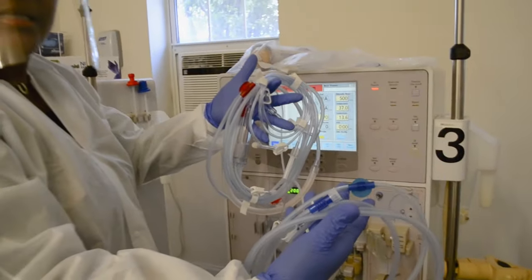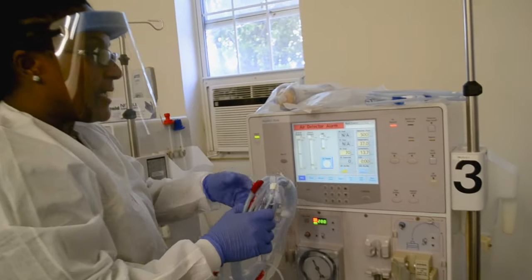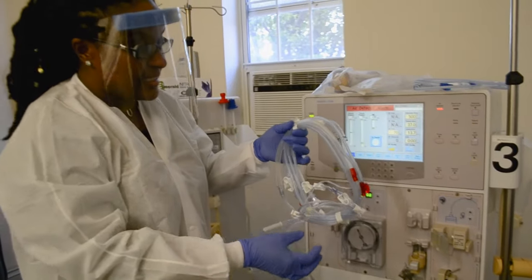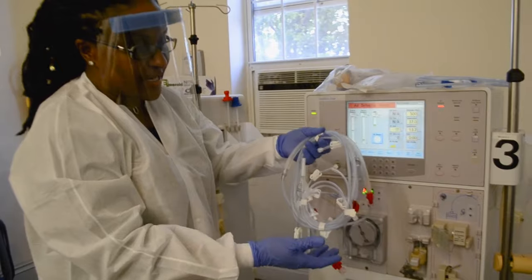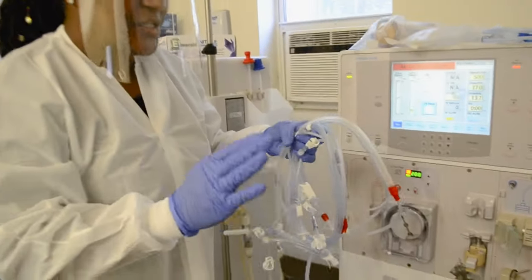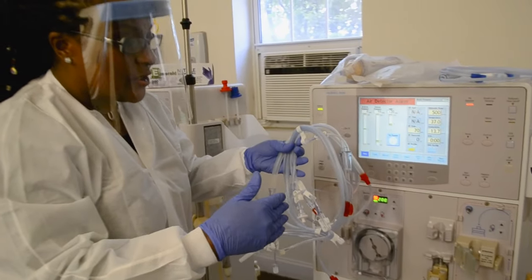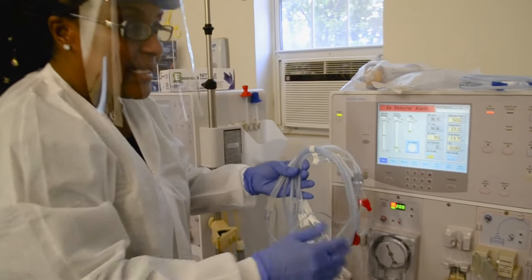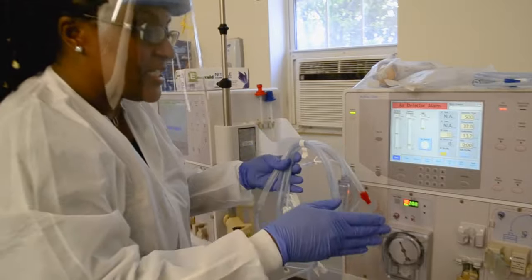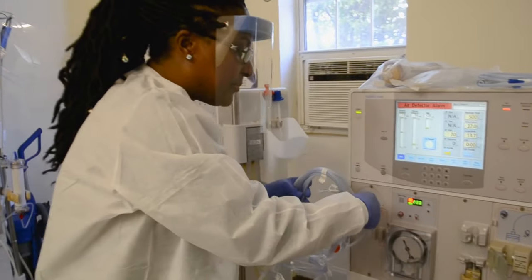The blue is your venous line and the red is your arterial line. We're going to rest the venous line on top of the machine and put the arterial line on the machine. Do not remove the protective tape or paper on the lines until you know exactly where you're going to put that part of the line. These papers help you to have more control of the bloodlines because you cannot have anything touching the floor. If any part of these lines touch the floor, it's considered contaminated, so it needs to go in the garbage and you have to start over again.